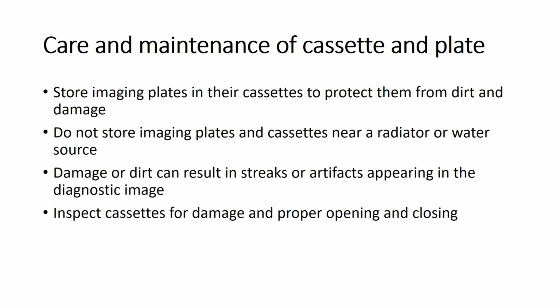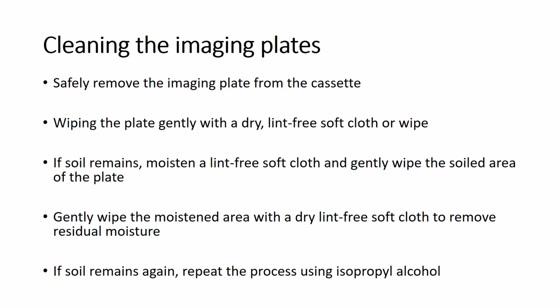So, damage or dirt can result in streaks or artifacts appearing in the diagnostic image. So you have to be very careful. Regularly you have to inspect the cassette for any type of damage, and you have to open the cassette and close it after cleaning, with the help of a technician.